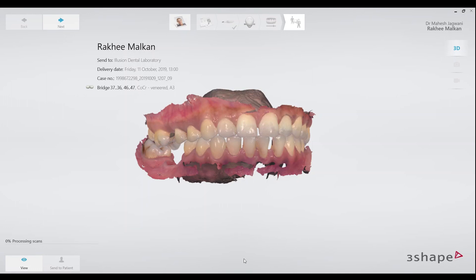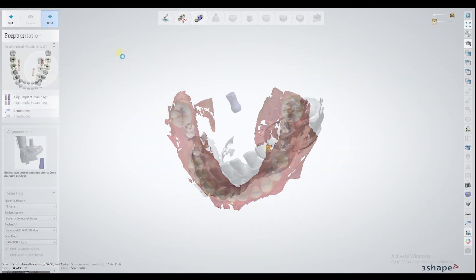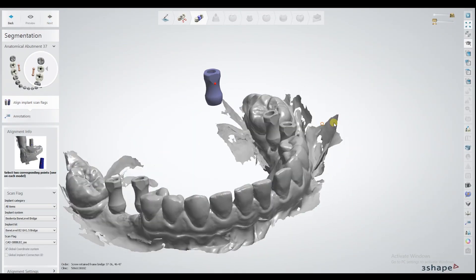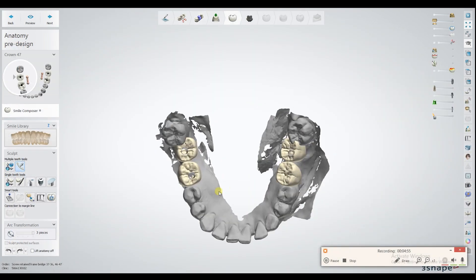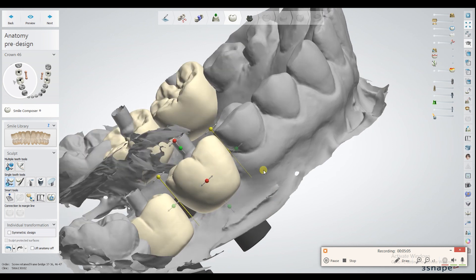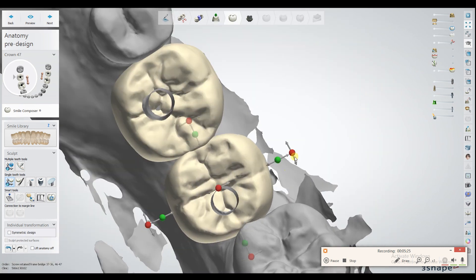In this way we can very effectively eliminate all manual steps which are likely to give some sort of error. The files are then received by the technician in a matter of minutes, and the technician starts aligning the scan bodies on the scan with the digital library in the CAD software and designs the prosthesis. We have planned milled screw-retained PFM restorations for this particular case.